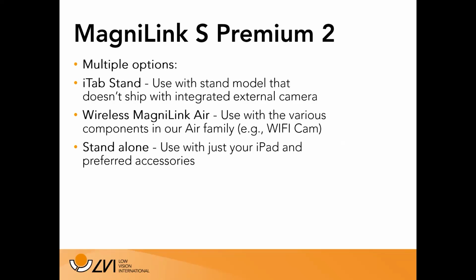We also have a whole series of wireless products that's called the Magnilink Air series. And there are two that are particularly popular within that series that we'll talk about in a minute. But the Magnilink S is something that can be integrated into that family of products and used in that way. And then people can use the Magnilink S just with your iPad. If your iPad's in a folio or in some kind of case that has a kickstand, you just open your iPad up, turn it on, launch the app, use that USB-C, plug it right in, and off you go. So just as a standalone plug and play.